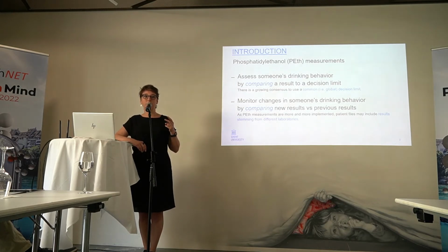Those two ways of handling a PEth result are exactly what happens when you are diseased. You have too low vitamin D, you go to the GP, he will measure it once and say, it's below 30, you're depleted, please supplement yourself. And then after a while, you go back, he will have a second measurement and he will compare. But maybe he has changed labs by then. So also there, he needs to make sure that the result is exactly comparable to his previous result. So we do exactly the same. That is what we try to do with these PEth measurements.